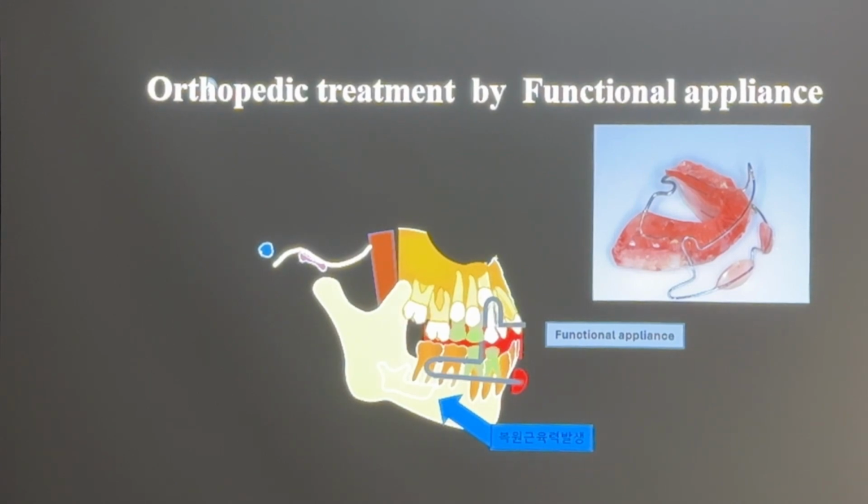So basically, we usually touch the whole surface in the upper. Touch the whole occlusal region, the occlusal surface, especially in the upper.